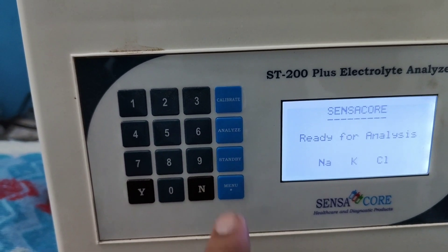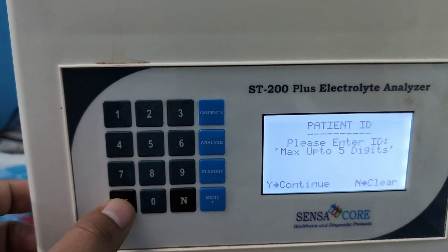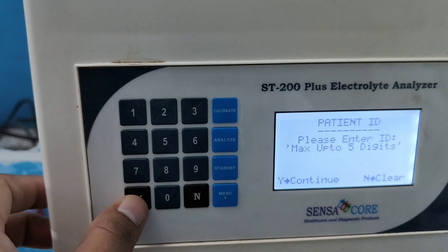I am going to analyze the sample, that's why I press the analyze button, then press Y for continue.